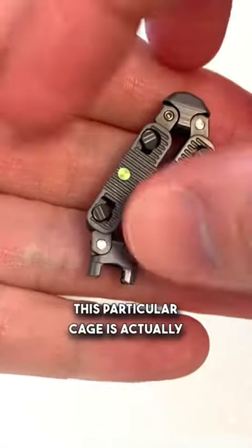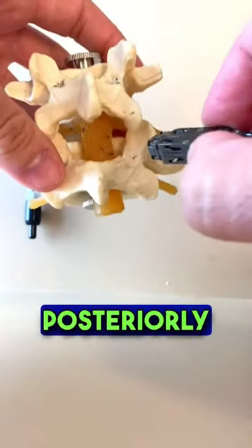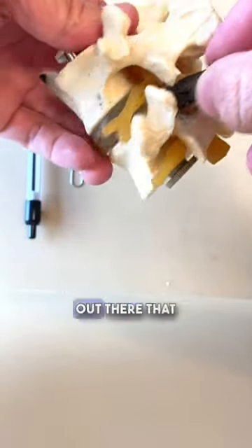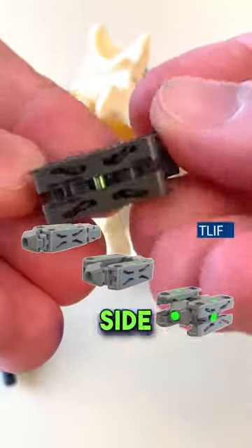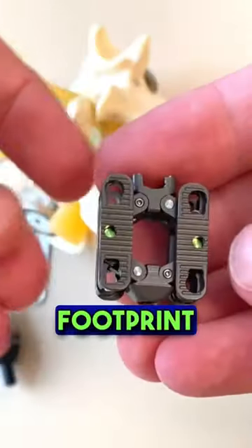This particular cage is actually pretty cool, and it's a newer form of technology. It's placed posteriorly — that means from the back — but the thing that makes this cage pretty unique is that it's one of the few cages out there that not only expands up and down, but also expands side to side. The reason that's a big deal is that it has a bigger surface area and a bigger footprint to help open up.